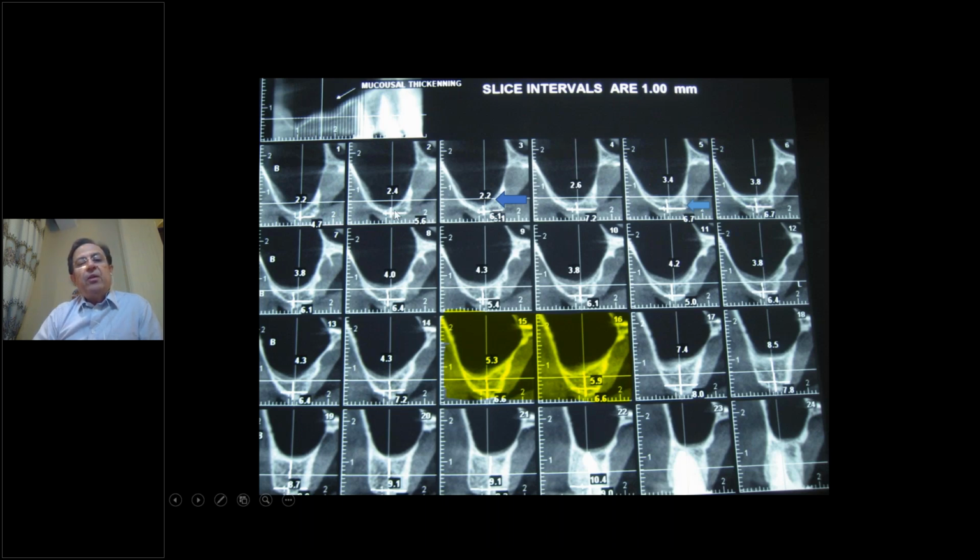The width of the crest is important, and in the cases where the surgeon does one stage with a little less than 3 millimeters of bone, mostly the width of the crest was good.